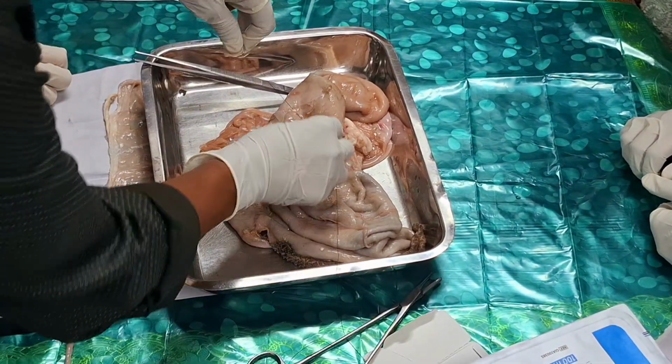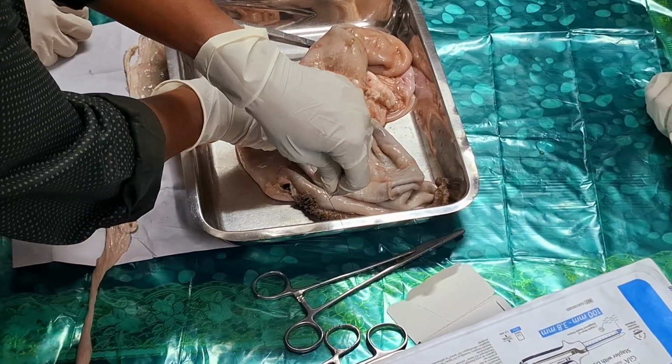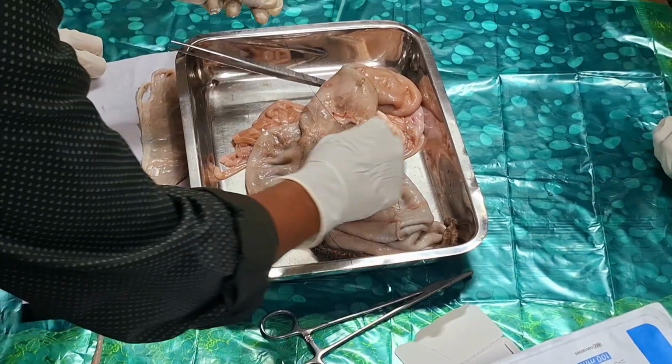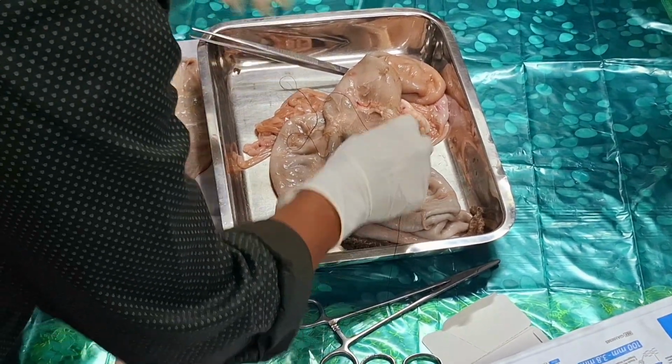If you approach, bring the bowel like this. You bring the bowel like this. This is pushing. Get a mask. Okay.